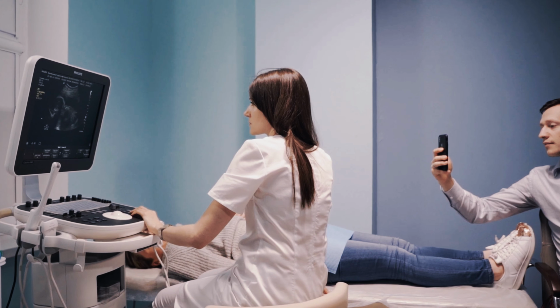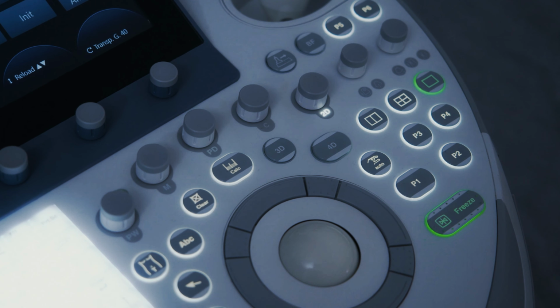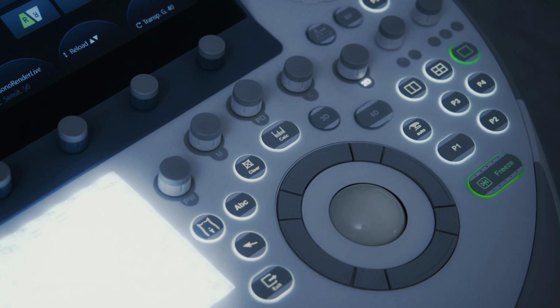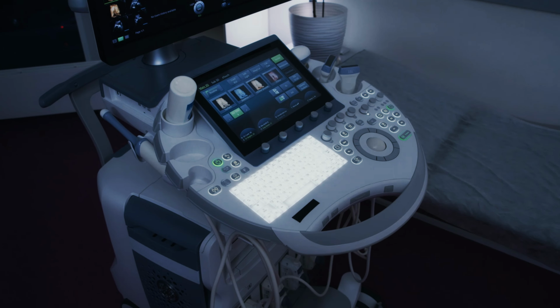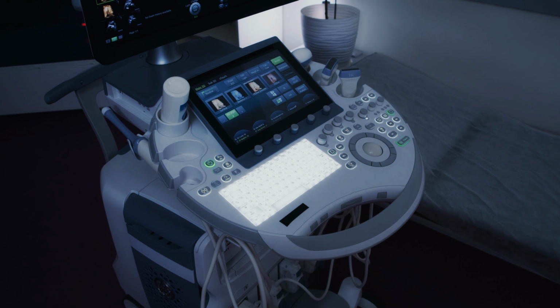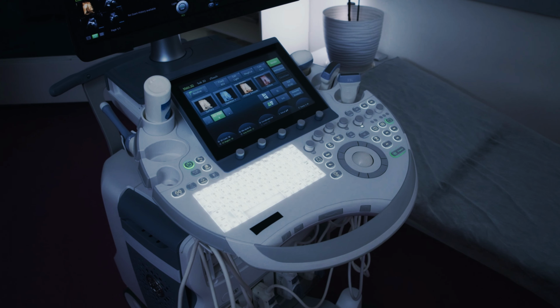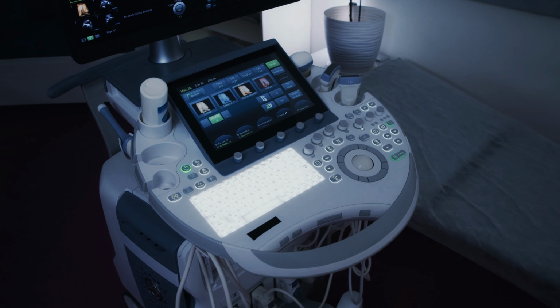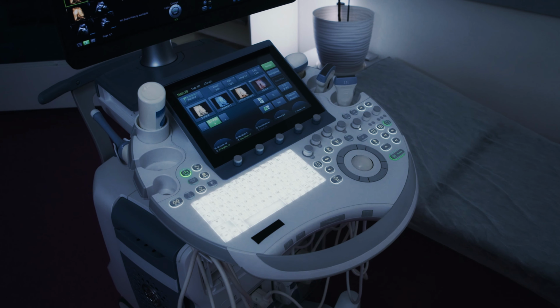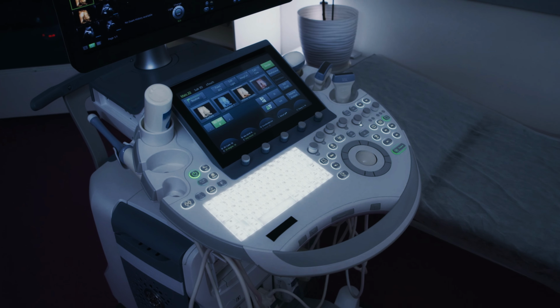Control panel. The control panel includes various settings that allow the operator to adjust image quality, depth, gain, and the mode of imaging, e.g., Doppler for blood flow. Transducer gel. A gel is applied to the skin before the transducer is used. The gel eliminates any air between the transducer and the skin, ensuring that the sound waves pass smoothly into the body for better imaging.